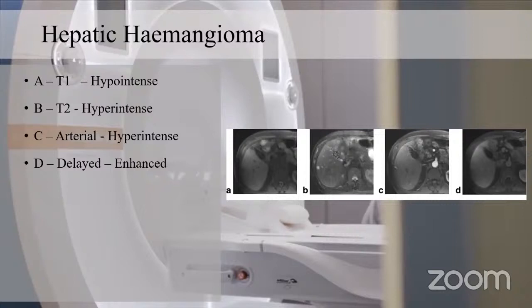After the contrast, the enhancement will usually be seen at 5 minutes or after 5 minutes. Now this is a delayed image, which shows enhancement. So the characteristic is that in hepatic hemangioma, contrast enhancement is seen in the delayed images.